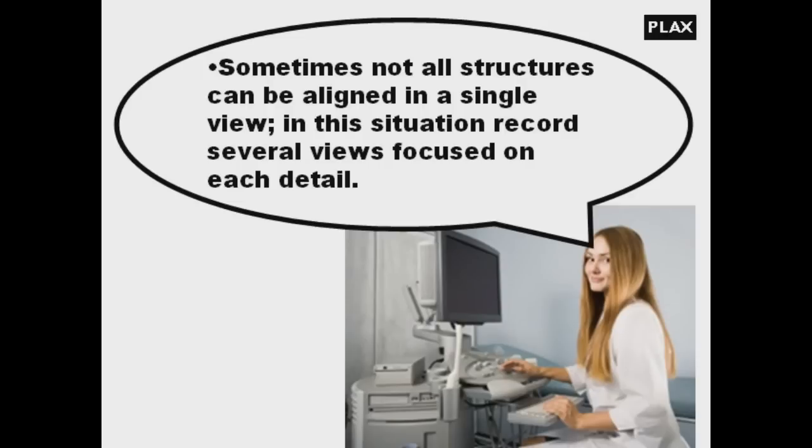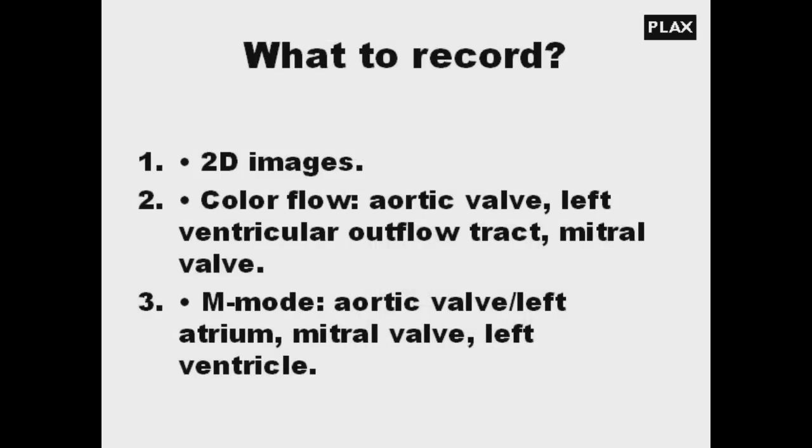Sometimes not all structures can be aligned in a single view. In this situation, record several views focused on each detail. All you can record in this view is important, but spectral Doppler is not accurate because of the perpendicular direction of the blood flow.